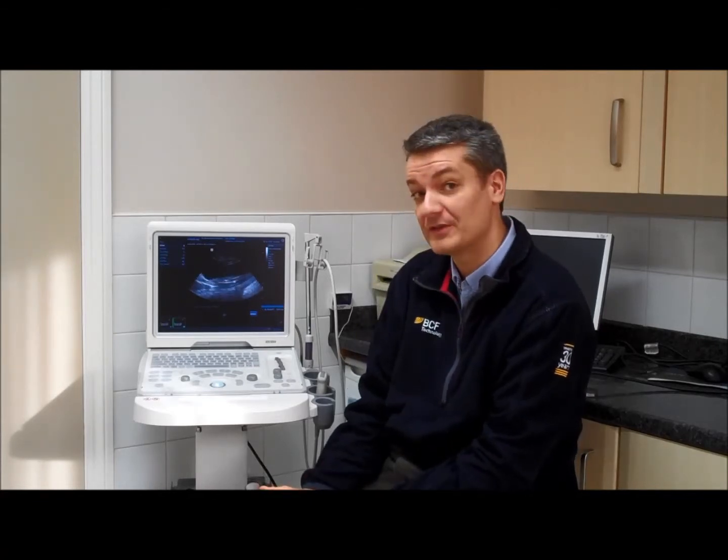The scanner is easy to use, has lots of great features, and is great value for money. It's ideal for a first opinion small animal practice, either if you're new to ultrasound or if you're looking to upgrade to a more up-to-date scanner.